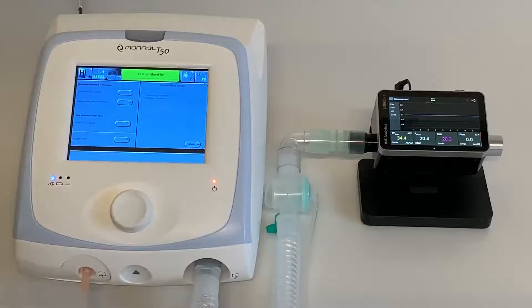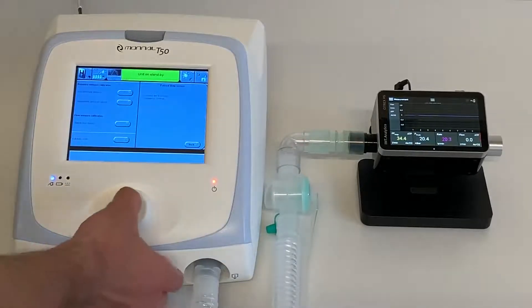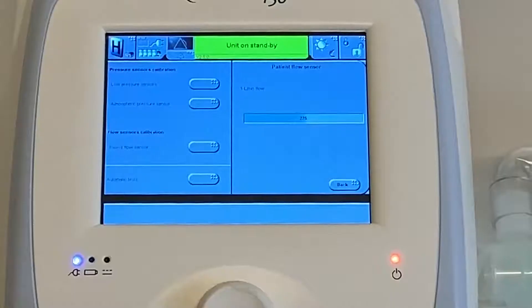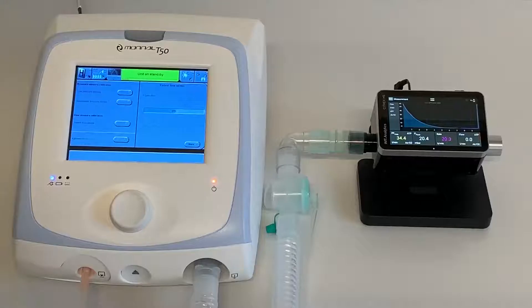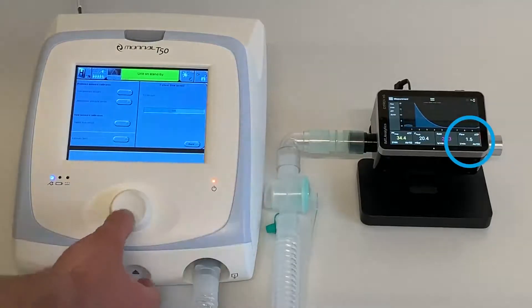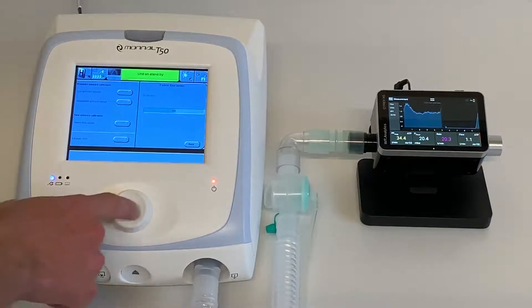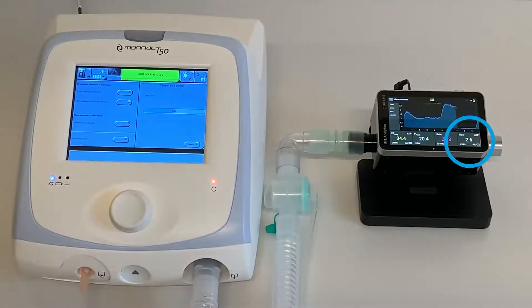Verify the Citrex H5 is connected. Press the control knob to confirm and follow the instructions on the screen. Verify the T50 is delivering a flow of 1 liter per minute on Citrex and press the control knob to confirm. Then verify the T50 is delivering a flow of 2 liters per minute on Citrex and press the control knob to confirm.